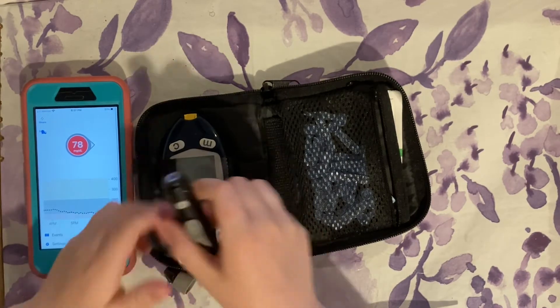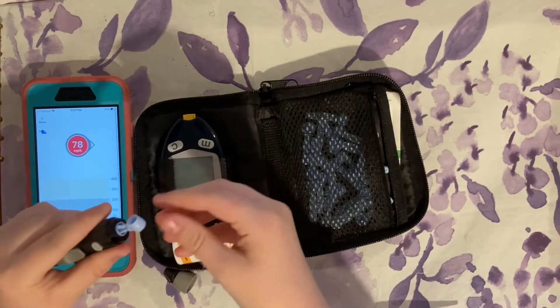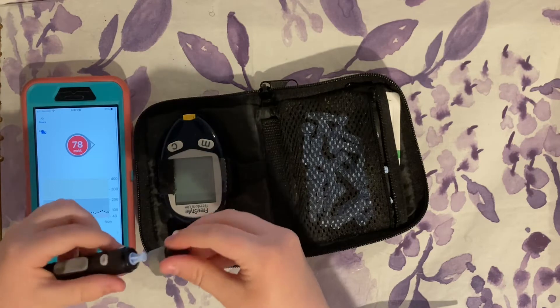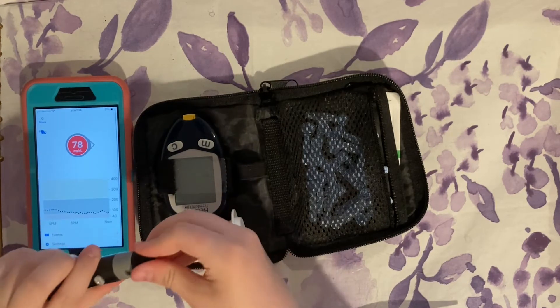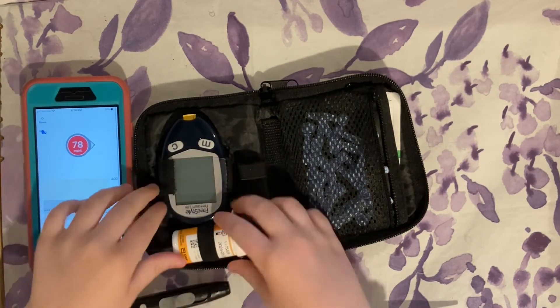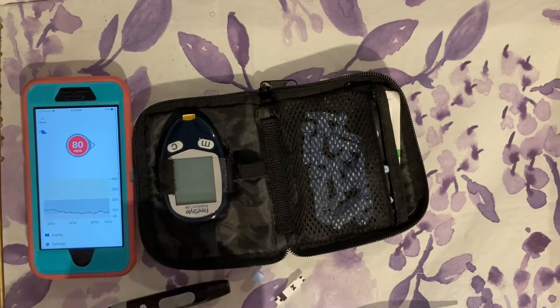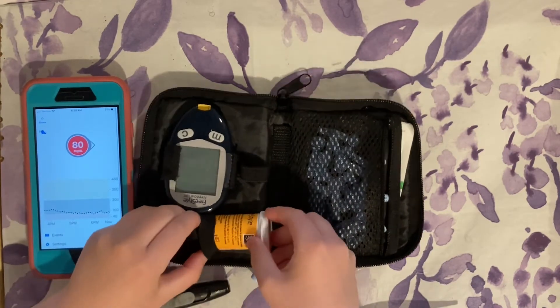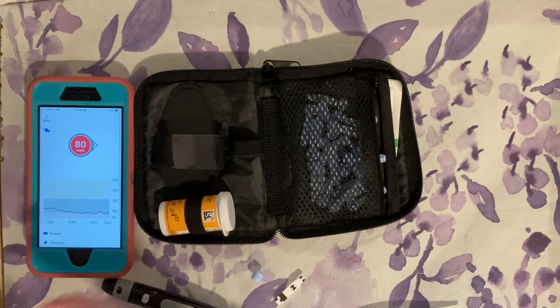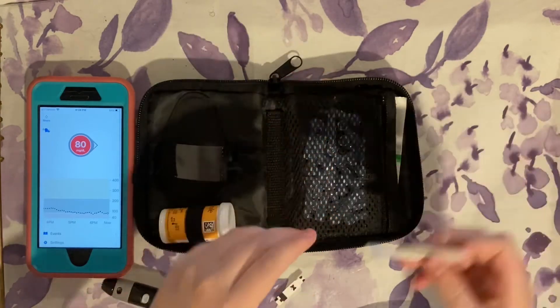To prep the lancing device, take the cap off, get your needle out, put it in, take the blue cap off, set that aside, put the cap back on, dial it to the right number, and pull it back. Then get your glucometer out and take an alcohol swab to clean your finger.